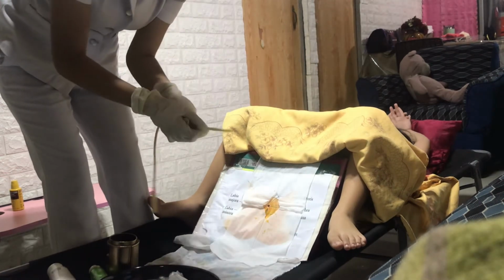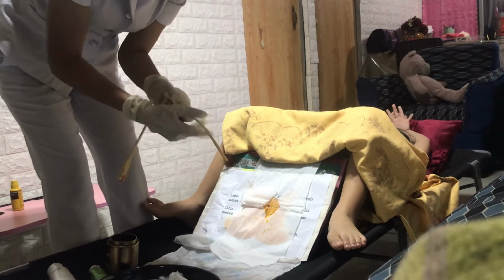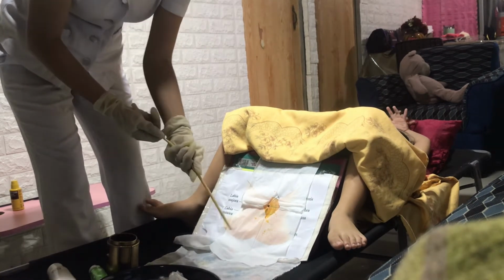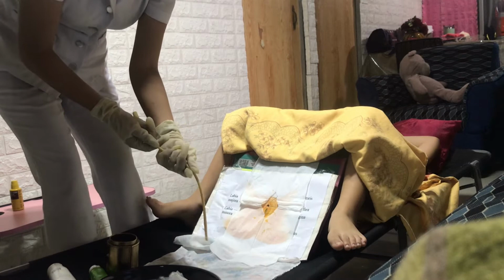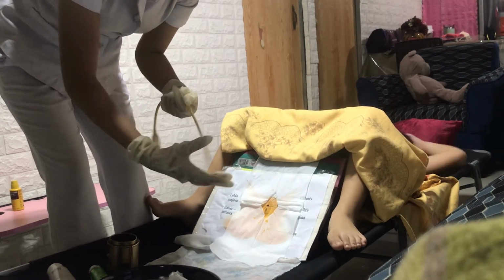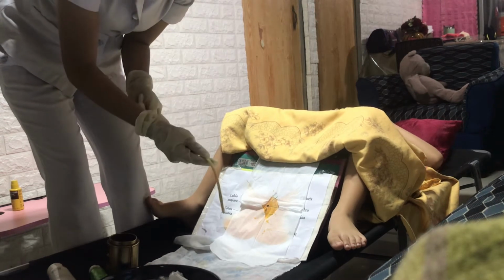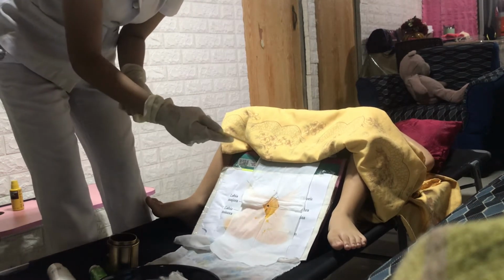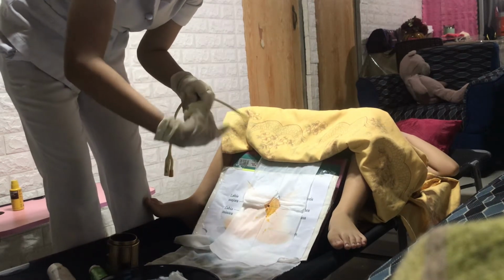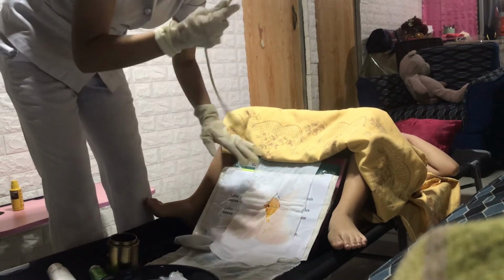After we lubricate the catheter, we need to pick up the catheter at least 3 inches from the tip. Place the thumb and one finger of the left or right hand between the labia minora. Separate and pull up gently. So 3 inches. 1, 2, 3. Then we'll insert it.